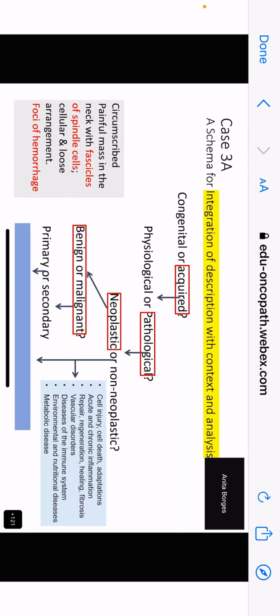You saw what all of us saw, but you came to the diagnosis of what? A vascular tumor. Yes, pericytoma. But when I described it, is my description made up, Vimi? You had the same description. Yes or no? Have I made up this description or did you describe it the same way?